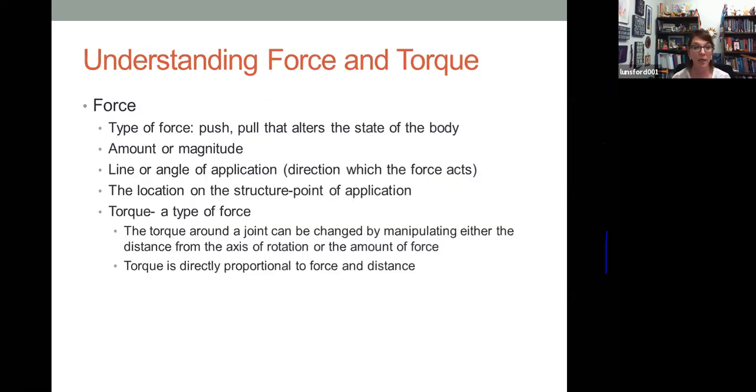I'm not going to go into big detail here about force and torque, but what you should know is that a mobilizing or static progressive splint or orthosis can cause force and torque on joints, especially the articular splints, the splints that are crossing joints. So even the static orthoses can cause force and torque. When you get into your mobilizing and dynamic orthoses and you're providing lines or angles that pull on something, the direction of the force matters. We're going to talk about that in a moment. We must be very careful with these to make sure we are providing an appropriate line of force so that we're not stressing or traumatizing stabilizing structures like ligaments, and that we aren't causing further tissue damage with an orthosis that is too aggressive and causing an increase in edema or irritation to the tissues.